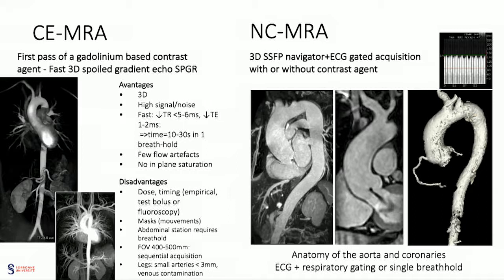When we look at what we can actually do, here are routine images acquired of patients for the full aorta. The full coverage is something that is really extremely interesting here in volume rendering and also time resolved acquisitions. This has huge advantages, of course, of being 3D. This is a very important feature. Obviously, a disadvantage is the use of contrast and the issues. I won't go too much into detail about this.